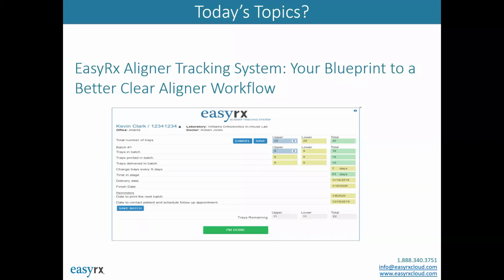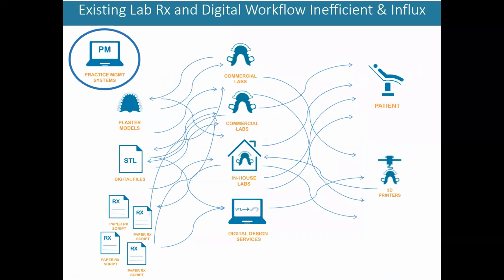But when you look at EasyRx as a whole software, the idea was to give practices a powerful tool to not only better communicate with the labs you work with, maybe commercial labs, in-house labs, but really give organization to everything you do, whether it's an aligner prescription or an appliance prescription. Maybe it's just that we want to be able to upload STL files into our cloud. We looked at the general workflow of most practices, and it's frankly all over the place.